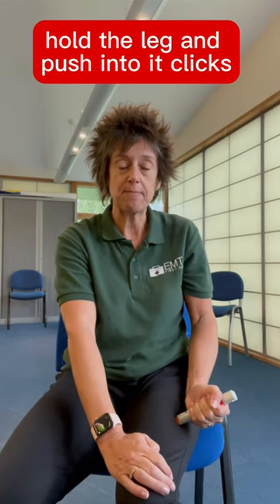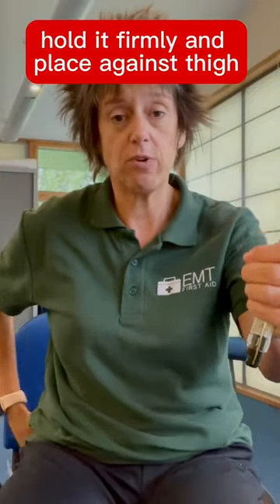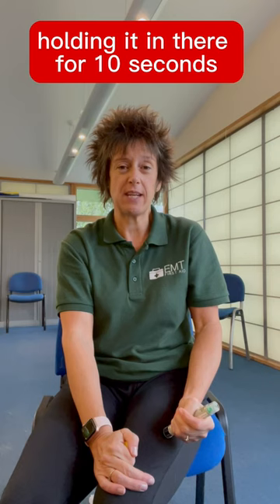Push until it clicks and hold it for 10 seconds. For the Jext, take it out of the case, hold it across the way, remove the cap from the top — the needle comes out the opposite end — hold and push, holding it in there for 10 seconds.